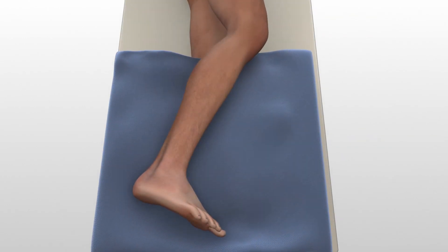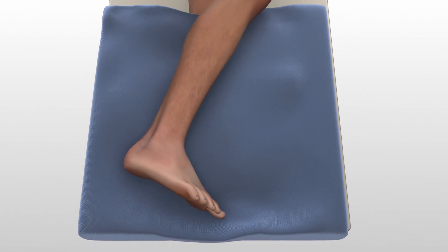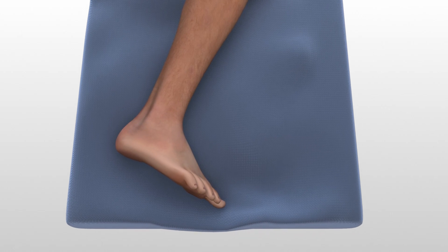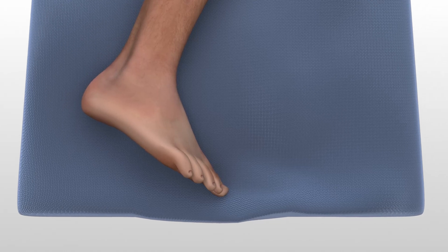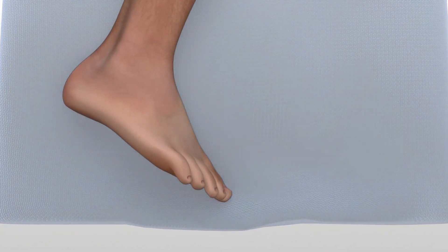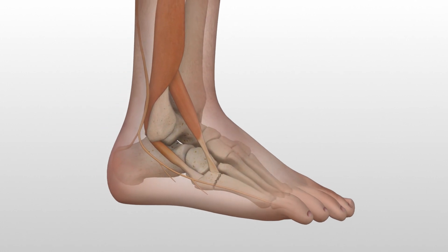Position the patient in a semilateral position, utilizing a beanbag body positioner. The patient should be moved to the distal end of the bed and the operative leg draped free as the side up. Extension of the operative limb should be checked prior to prep and drape to confirm that the operative limb can be positioned on the mini C-arm during surgery.